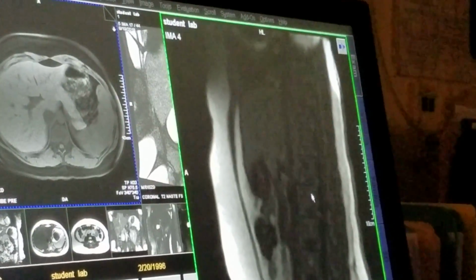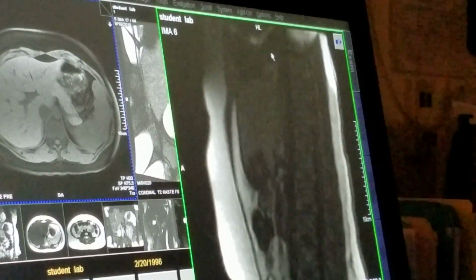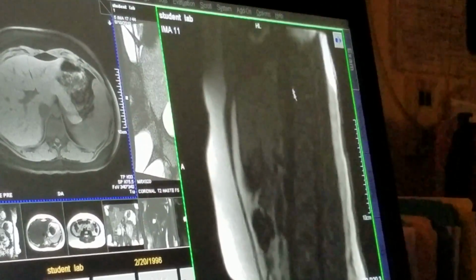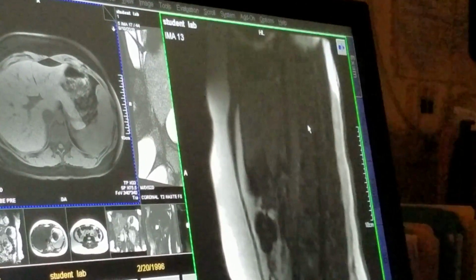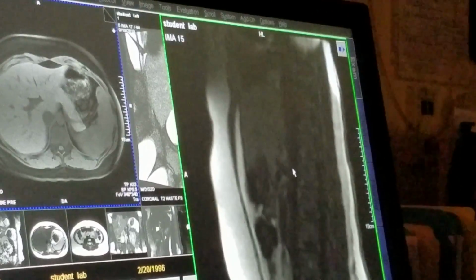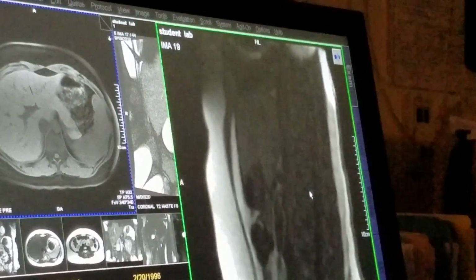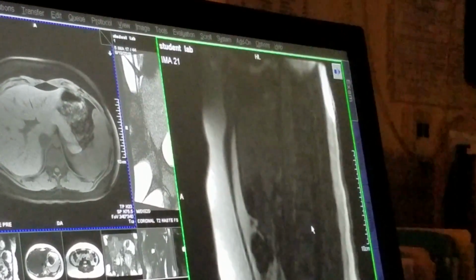So here you see the anterior part of the heart, here's the posterior part of the heart, and you'll start to see the thoracic aorta here. So once you run it, and it's starting to run, you see that there's no artifact, the care bolus itself is running fine, then you inject the contrast, and then you wait.